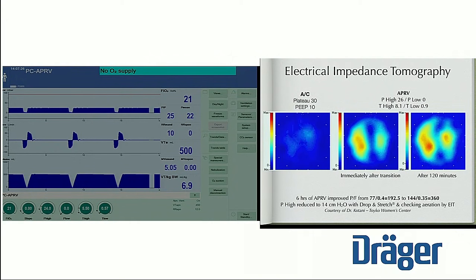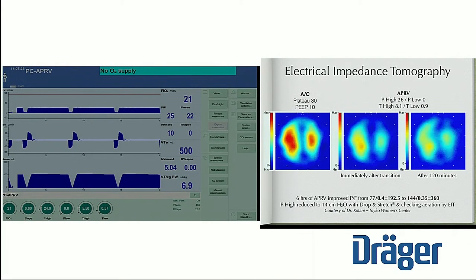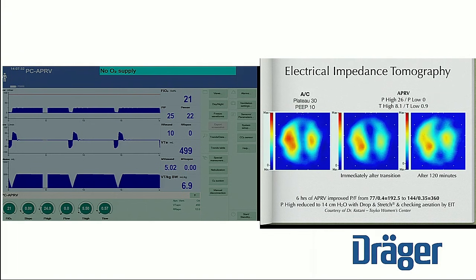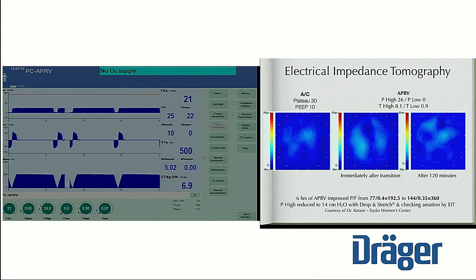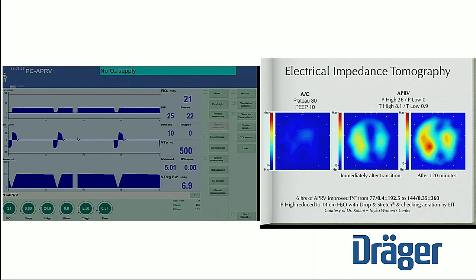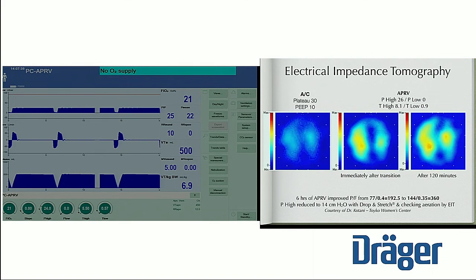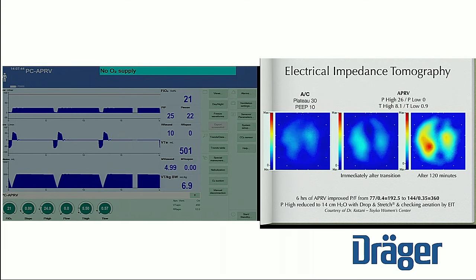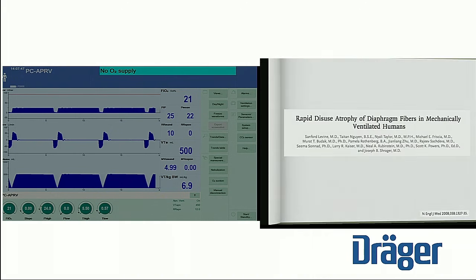Just briefly on EIT: this is the maximum aeration on low tidal volume strategy. The patient's not breathing very well here, but the patient is starting to breathe here, and you can see there's a shift more to the basilar part of the lung when you actually start spontaneous breathing.